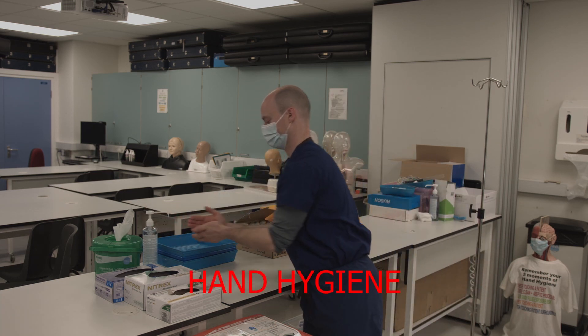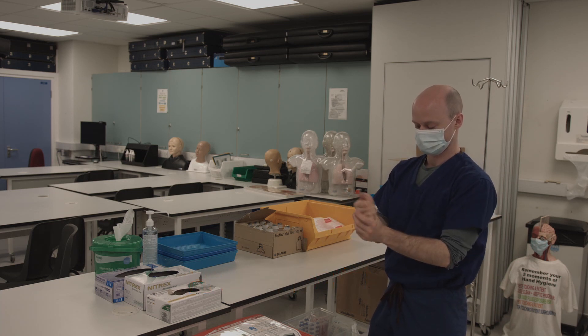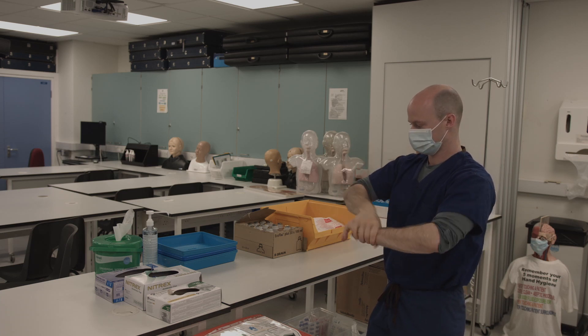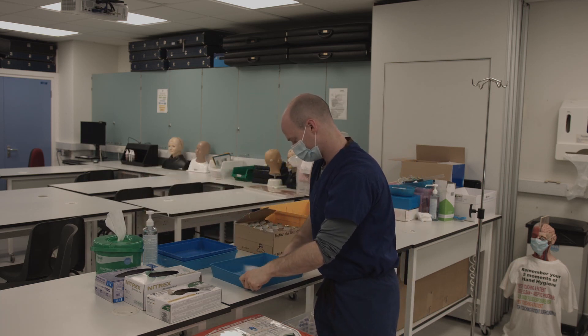To start the station you will prepare a saline infusion and you should begin by cleaning your hands thoroughly with the alcohol gel available. Once this is done you can collect your tray and clean it with a chlorhexidine wipe, ensuring to start from the inside of the tray and working outwards.